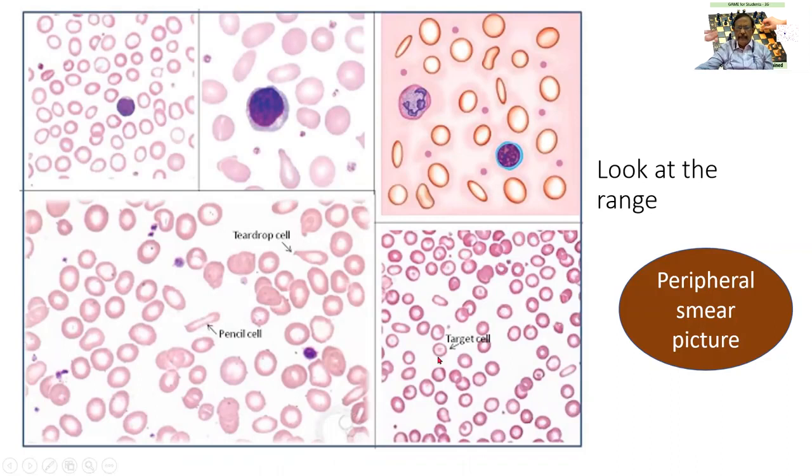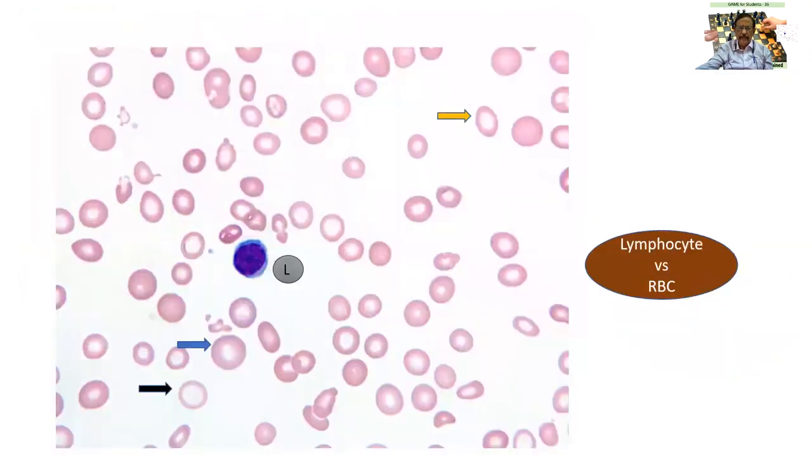This is a beautiful spectrum of pictures that have been downloaded. I would like you people to kindly appreciate the thin hemoglobinization around each cell, leaving a large central pallor. One thing that strikes me is the pale nature of the RBCs. Also, when compared with the lymphocyte, the size is lesser. This we should have in mind. The rest of it we shall see in the forthcoming slides.